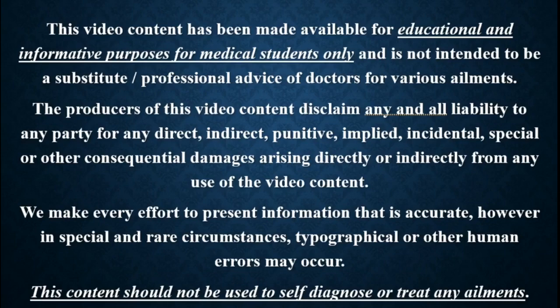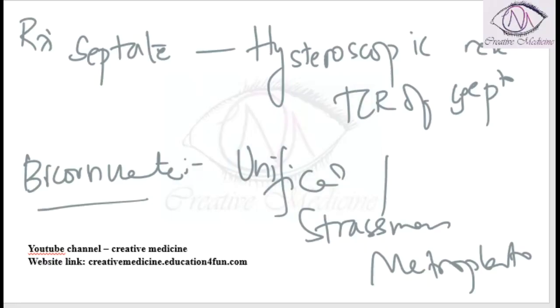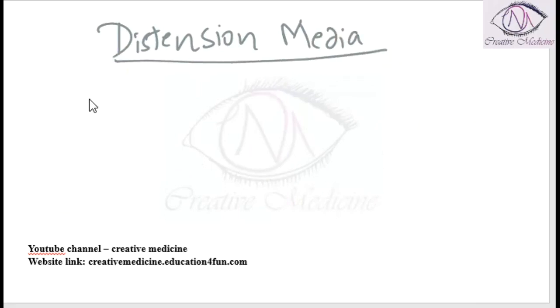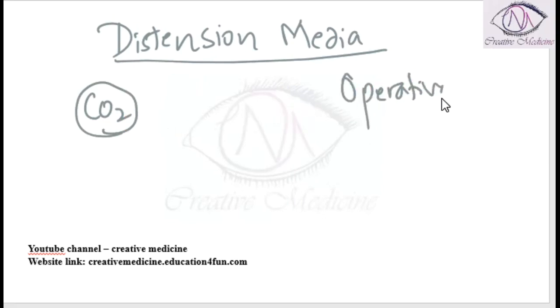In this lecture, we will learn about the distension media used in hysteroscopy. In diagnostic hysteroscopy, the medium used for distension is carbon dioxide. In operative hysteroscopy, the medium used is fluid.